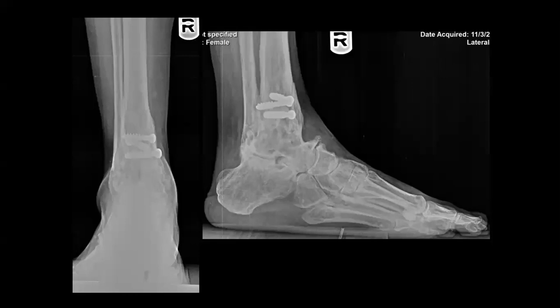Sure. Two views, AP lateral. Dorsal osteophytes noted on the talar head as well as the navicular dorsal aspect. The ankle, you said, is either severely arthritic or you said it wasn't fused, but I'm not seeing any sign of an ankle joint whatsoever. Correct. Hardware seems intact.